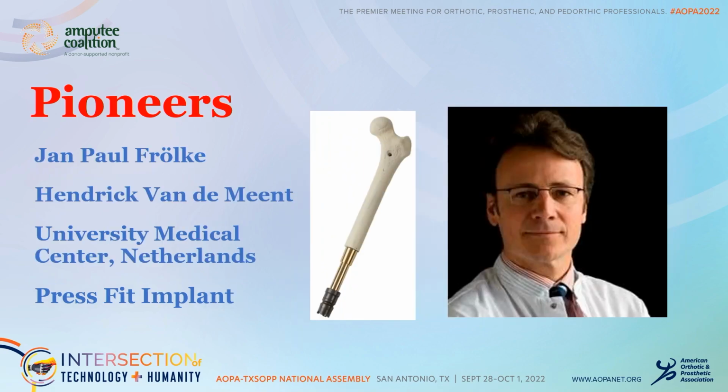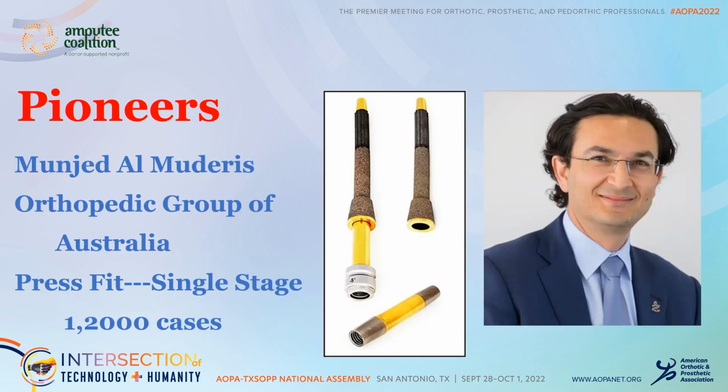That was further developed by Doctors Frölke and Van de Meent, who are in the Netherlands, who not only had modifications of that press fit, but they were the ones that really focused, for press fit implants, on using a team approach with rehabilitation, with a prosthetist on the staff and physical therapy as part of the package. They've also done some excellent studies that we'll talk about in just a few moments.